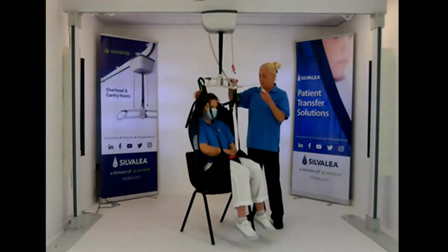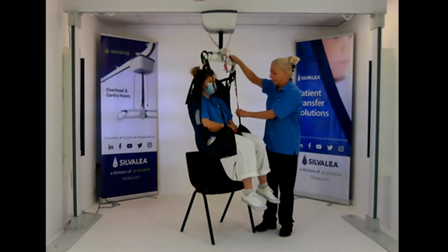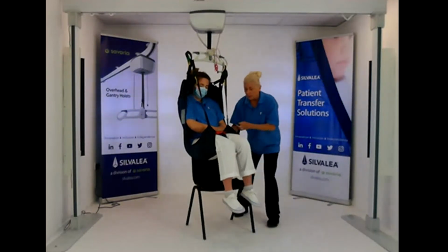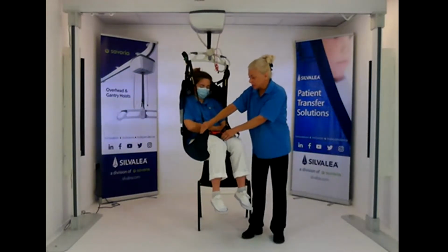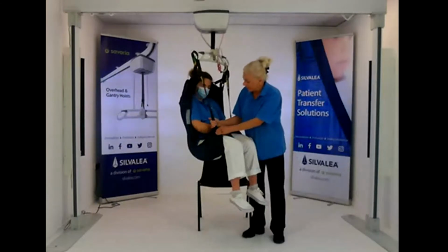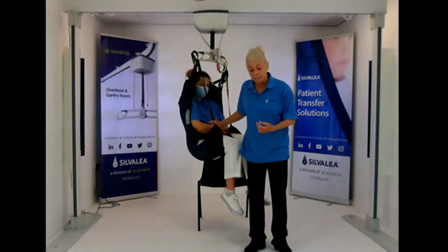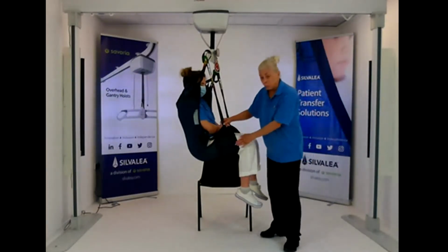Okay, right. So deluxe leg shapes, I think, they're really useful if you've got anybody that wriggles. So if you wriggle, the individual paddles on the legs will naturally go with that person. If you've got someone that's got a severe curvature and they're very asymmetrical, then they will adjust because they're separate. And also because the sling is being attached from the outside here, it's picking up the outside of the leg, which means it's much more comfortable than if you can picture a traditional general purpose shape that comes through the legs. So this one is much more comfortable, giving more femur support here.